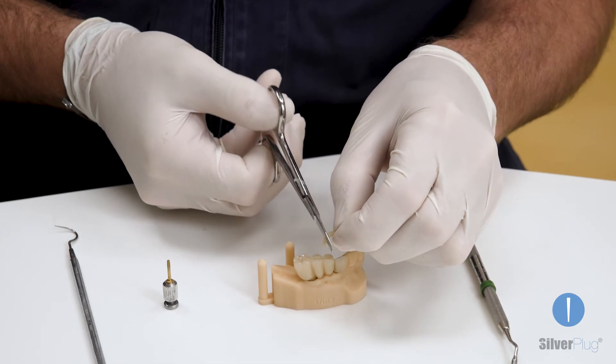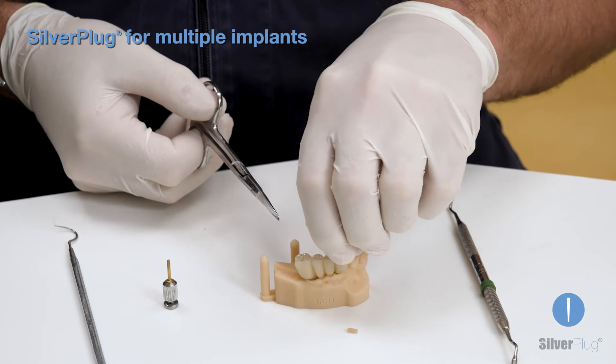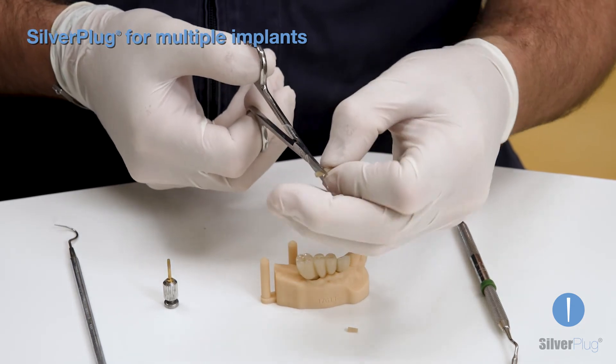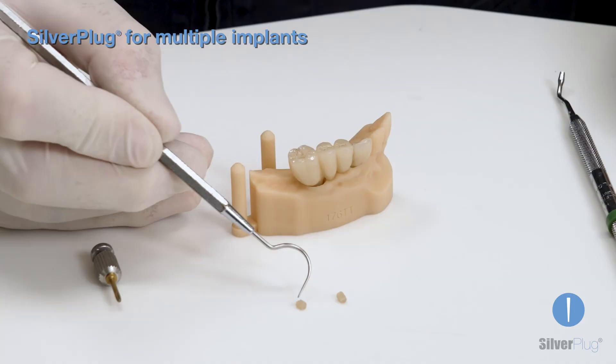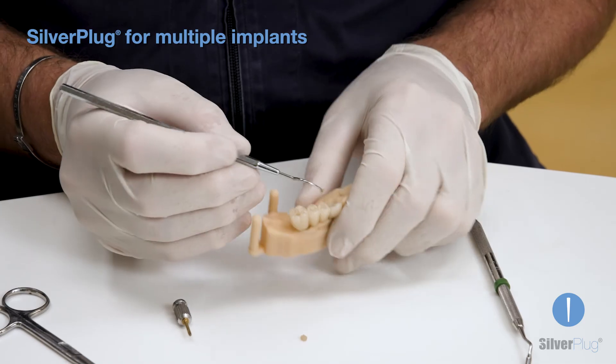In the case of a bridge with several elements, it is possible to use only one Silverplug, obtaining several sections. In this example of a two-piece bridge, it is sufficient to remove the thinnest part and obtain the two sections that correctly fit to the diameter of the tunnels.